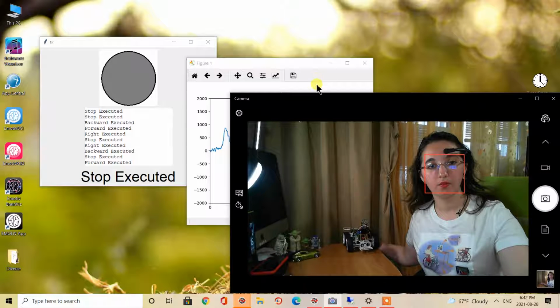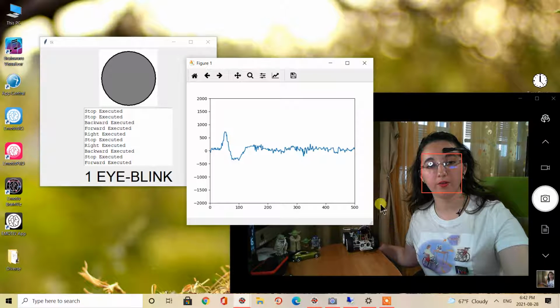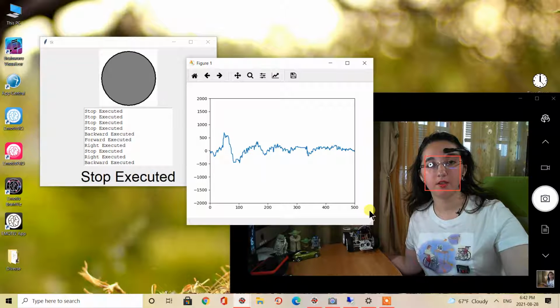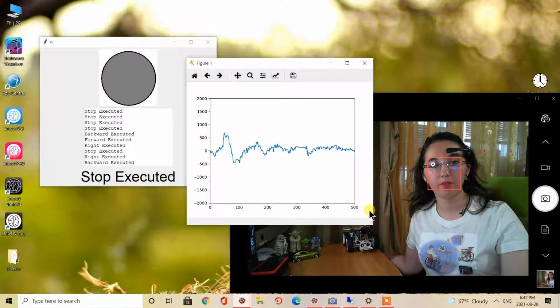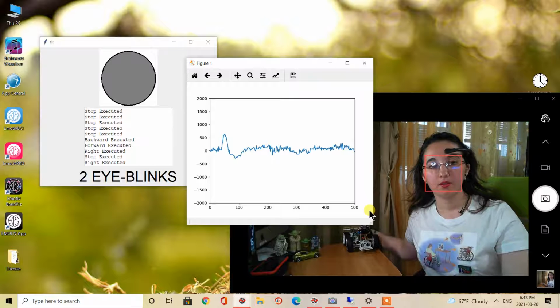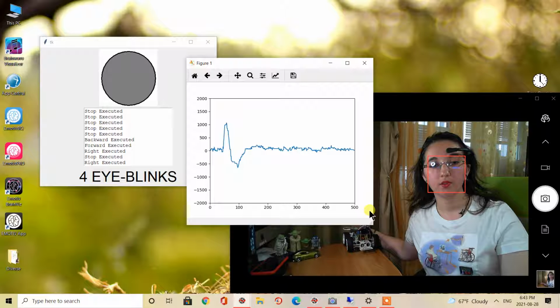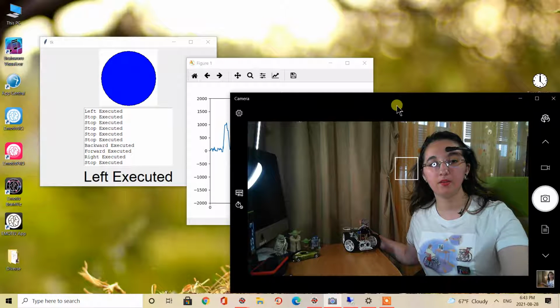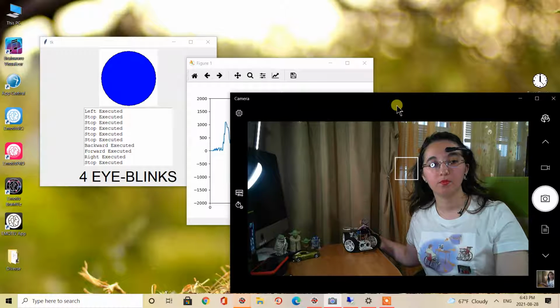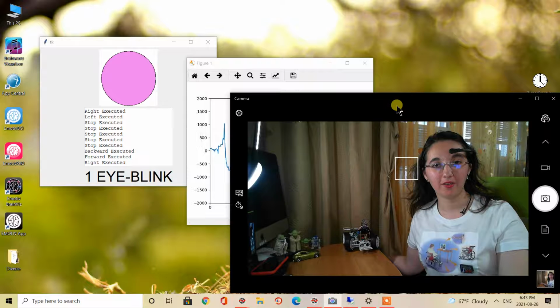Also, there were acquired approximately 500 samples during 1 second. This is a quite difficult task because it means to set a time interval of almost 2 milliseconds between acquiring each raw EEG sample, and this task should be accomplished by all the computers. Turn left and turn right. Five eye blinks. This was my application, a simple brain-computer interface.